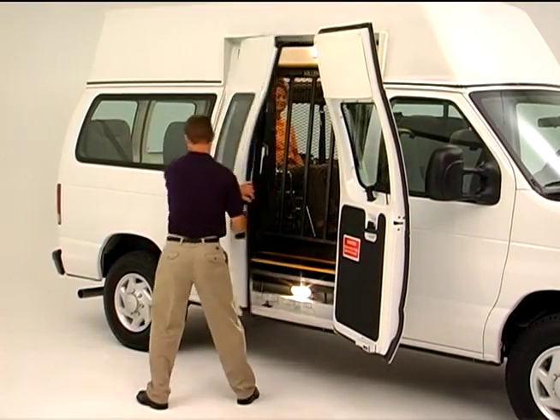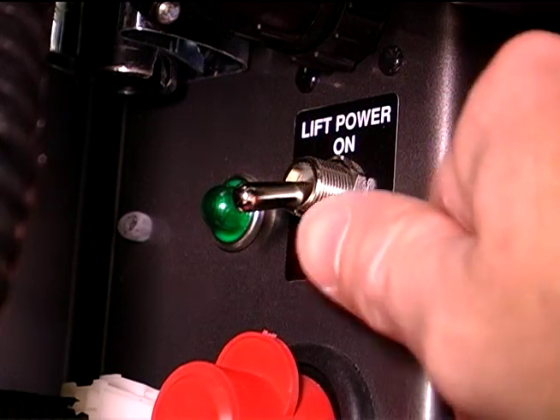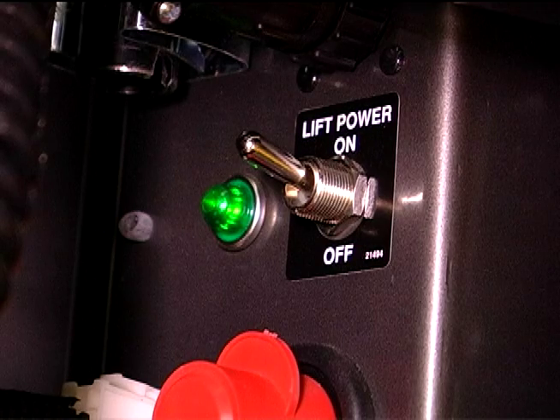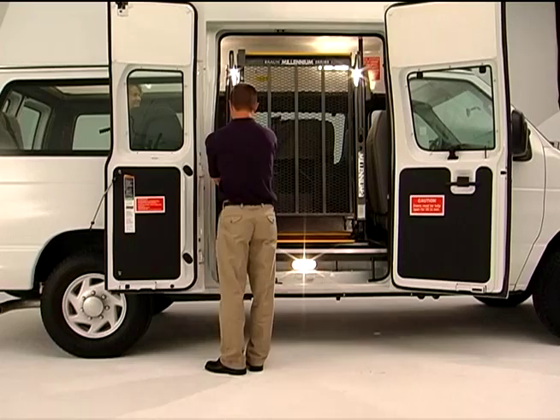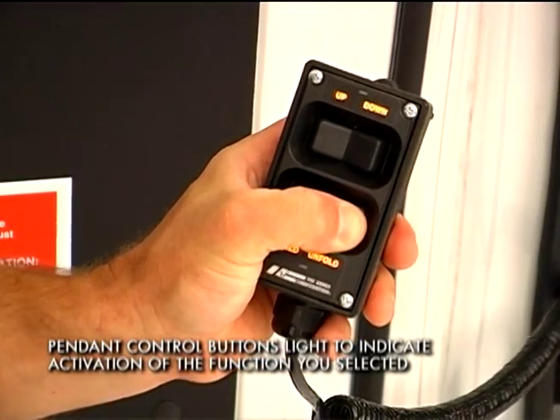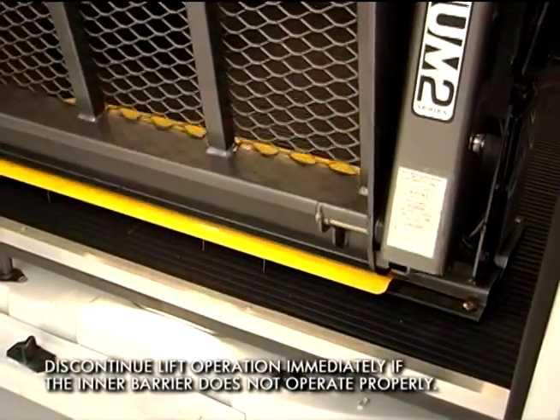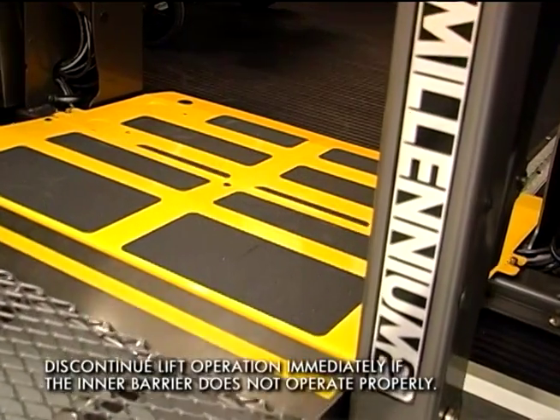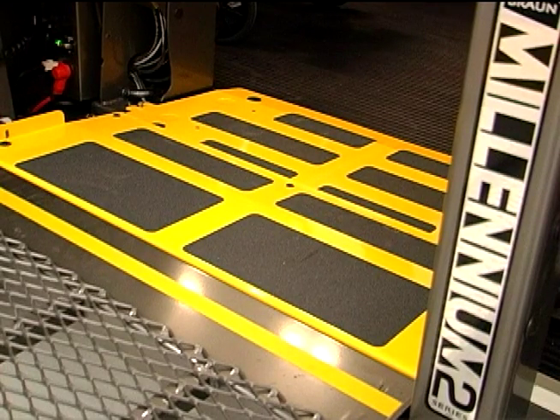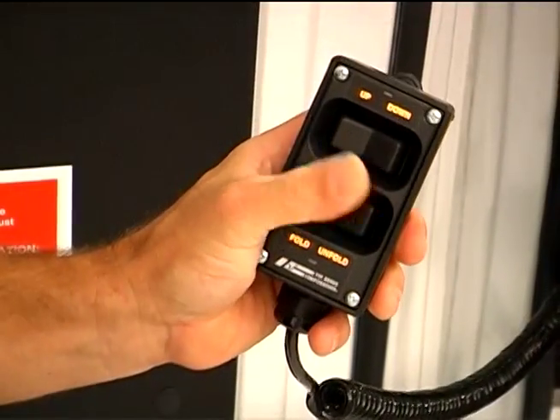To unload a passenger from the vehicle, begin by securing the vehicle door to avoid interference during lift operation. Confirm that the power on-off switch shows a green power indicator to signal that you're ready to activate the lift. Assuming that you have a green light, move away from the door to clear the area for the platform to fully unfold. Then press and hold the Unfold button on your Pendant Control and the lift will move out of its storage position. As the Unfold button is pressed and the platform is fully extended, the lift's mechanical inner barrier automatically rotates to the horizontal position to form a smooth transition between the vehicle floor and platform. Once the platform is fully extended and motion stops, release the Unfold switch.